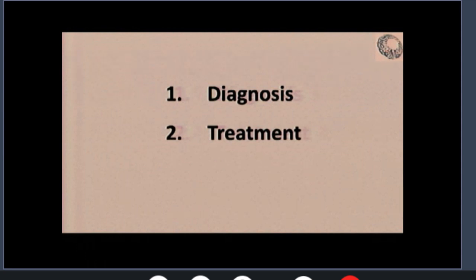Without, and I didn't have any choroidal effusion. Yeah, I took the risk. I called retina, it was with me, but we didn't do anything else. But it was the highest power lens I ever implanted. 52 diopters, in the back. And single, I didn't do a piggyback. It was a single 52 diopter lens done for this lady.